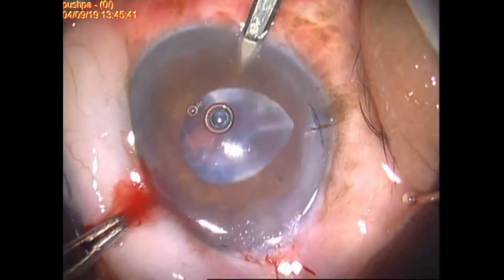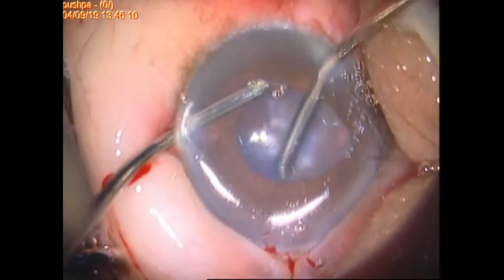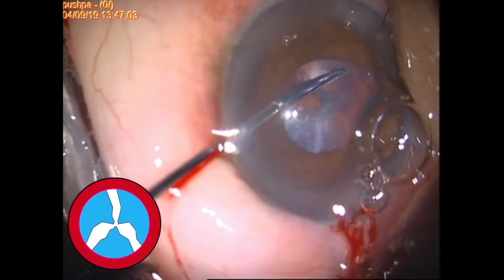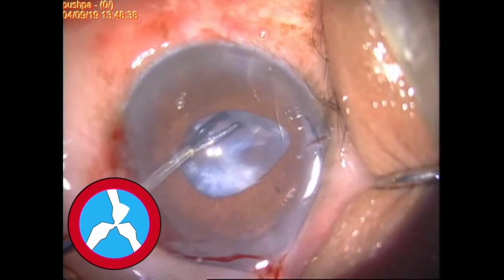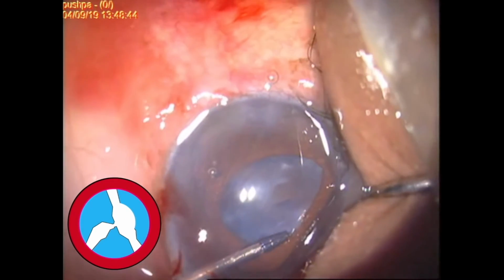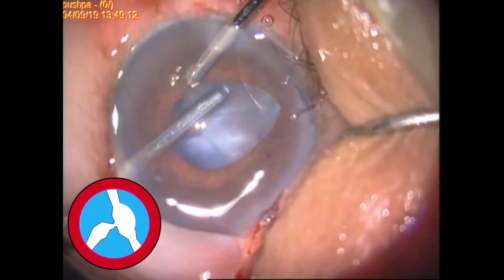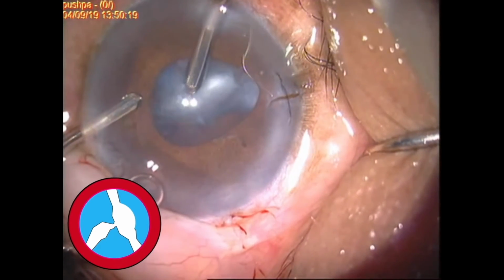Another paracentesis was placed for comfort of cortex aspiration. Mindful cortex aspiration was the key without capturing the remnant anterior lens capsule. There is a guided animation on the bottom left provided to depict the creation of a circular edge for one apex of the anterior capsular flap remnant, followed by residual cortex aspiration. The idea was to try and create a circular axis with the three triangular flaps so that IOL can be placed in the bag.